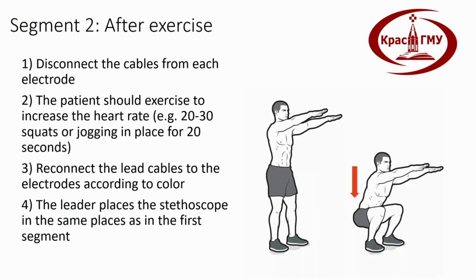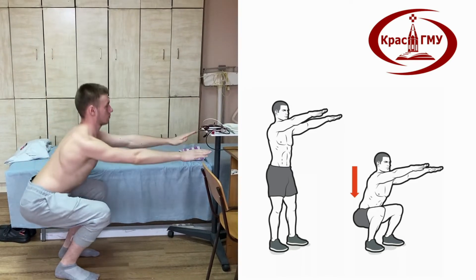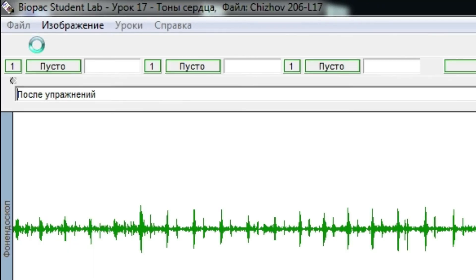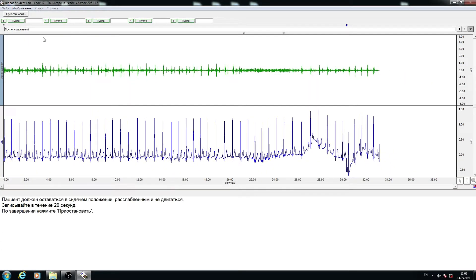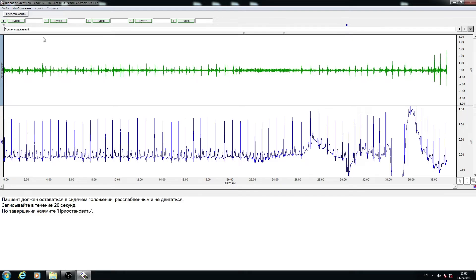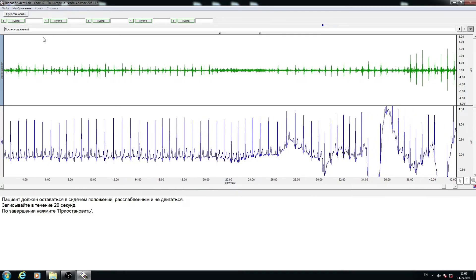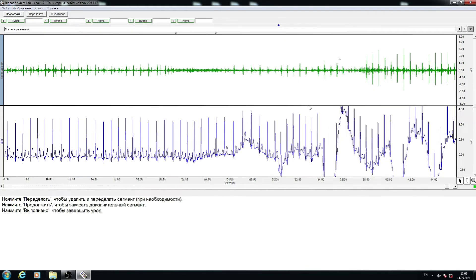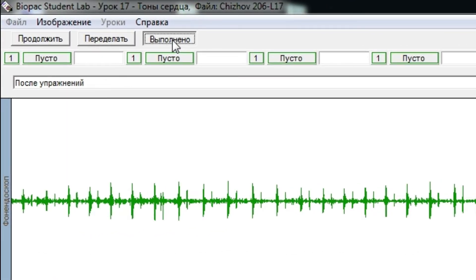Segment two — after exercise: Disconnect the cables from each electrode. The patient should exercise to increase heart rate — 20 to 30 squats or jogging in place for 20 seconds. Reconnect the lead cables to the electrodes according to color. The leader places the stethoscope in the same position as in segment one. The registrar clicks Resume to proceed with registration; the marker 'patient after exercise' will be set automatically. Upon completion, the recorder clicks Suspend, then clicks Done and confirms that registration is complete.